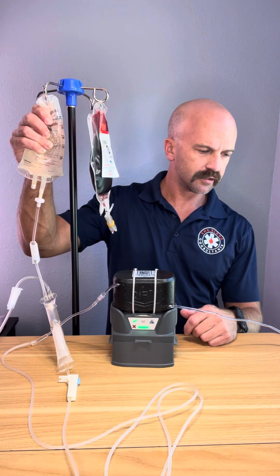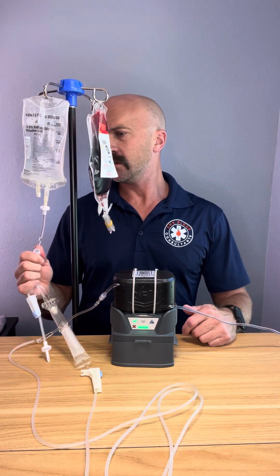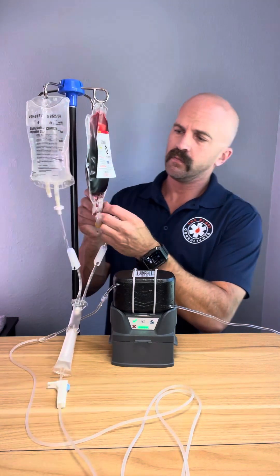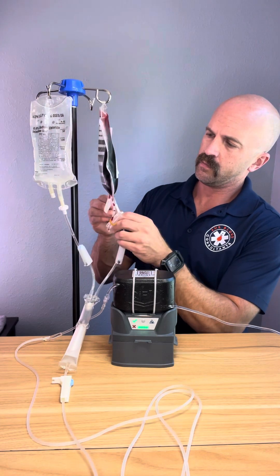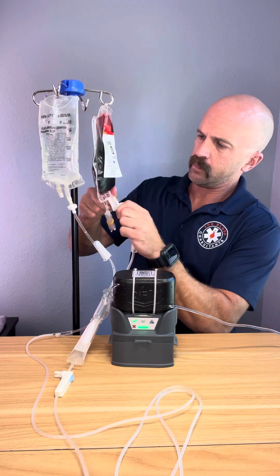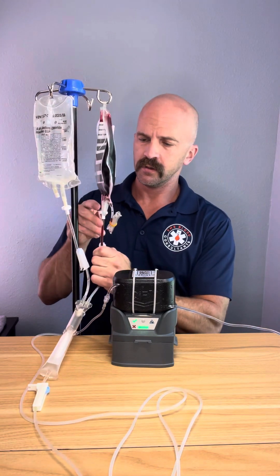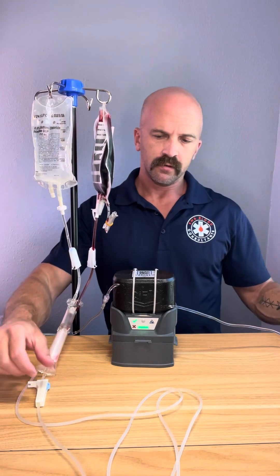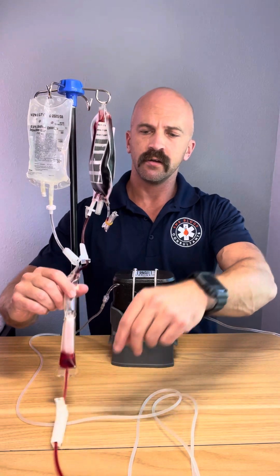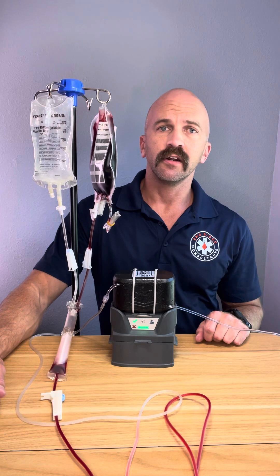Once we've got that flushed, we're going to check our IV to make sure it's patent. Then I'm going to go ahead and hook up my blood. I'm going to shut off my saline, transfer over to the blood, and we can see it change in the drip chamber there. And that's pretty much it — we are ready to flow blood.